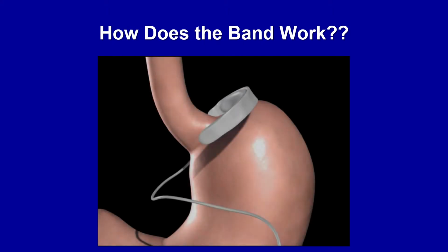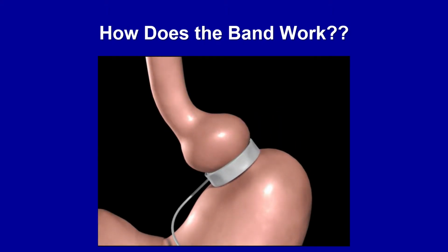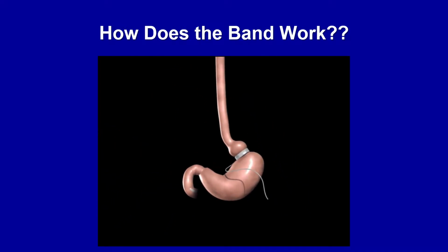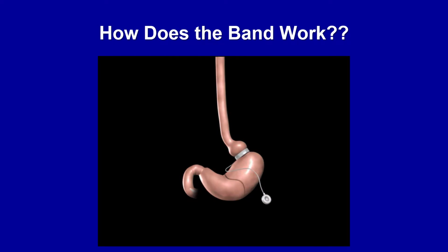It's going to wrap just like a belt around, leaving about a golf ball size portion of stomach above the band, which is pinching down. Then we bring the tubing that's attached to that little inner tube temporarily out through one of the incisions, and a little button, which is called a port, is attached to the tubing, and the whole thing is tucked inside.